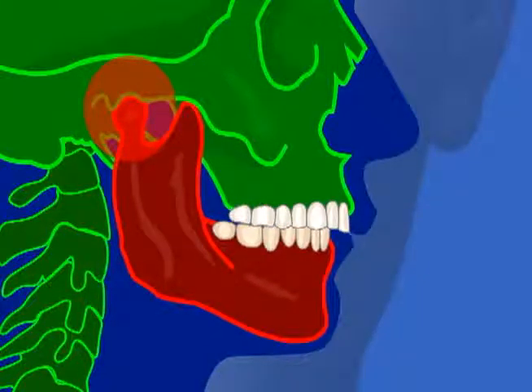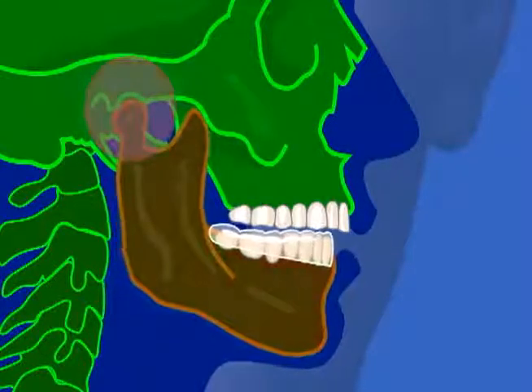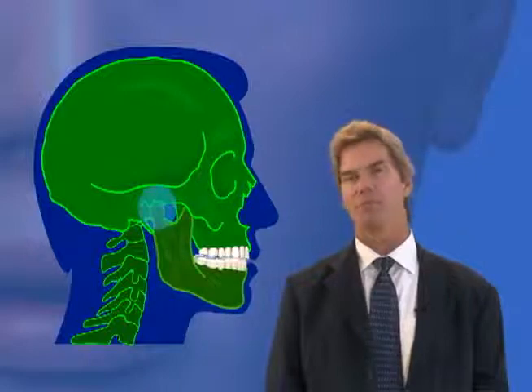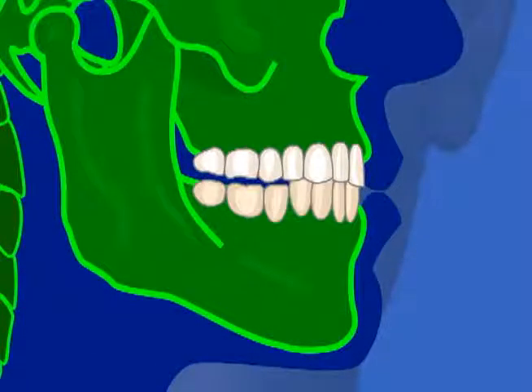If we find that the appliance is bringing the desired relief, we then can change the bite relationships in order to make this change permanent. On a trial basis, we can advance the lower jaw using the removable appliance I mentioned before. Once we have determined the proper jaw dynamics, we then bond tooth-colored composite to the biting surfaces of the back 2 teeth on either side. We then bond composite to the backside of the 2 front teeth, thus creating the stability needed to hold the bite in the new, correct neuromuscular position.